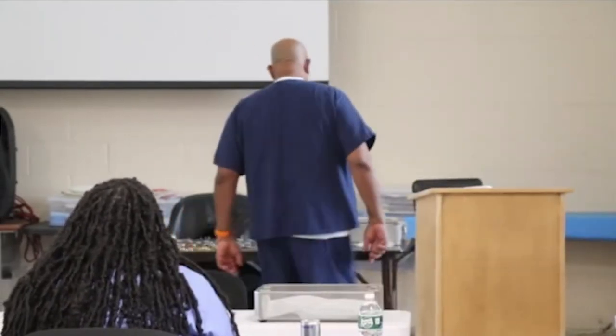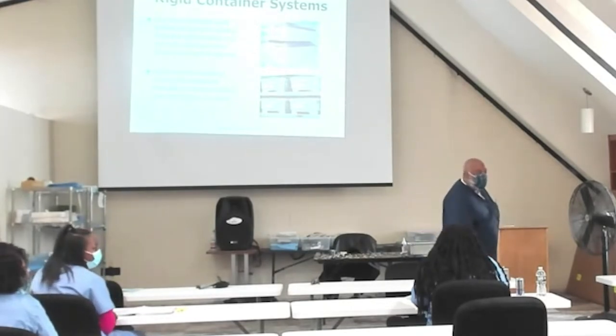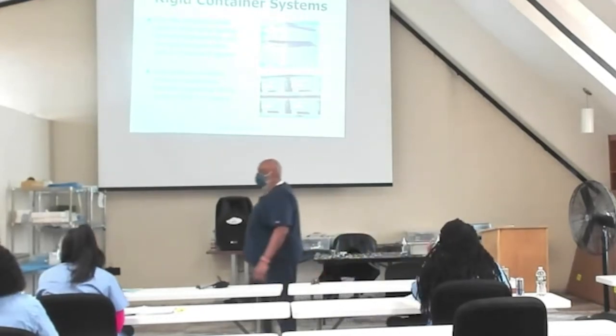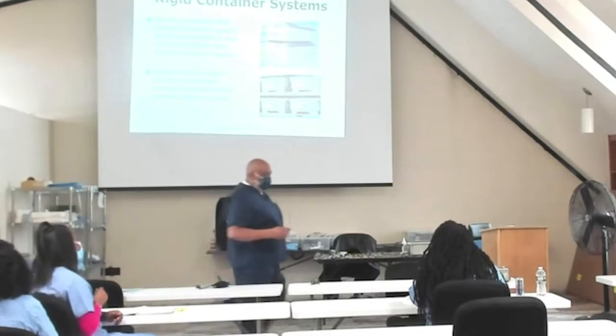The indicators. What kind of indicators? Class five. Where did I put them? In the middle? Put them in the corners. Why in the corner? Say it. That's a good answer. That's not the one I want, but you gave me half of it. You said put it in the corner. That's good. Give me something else. What is it about the corners? Come on, Shanique. It's the hardest place for the steam to get to. So if it gets to the corners and it's good, then we're good, okay?